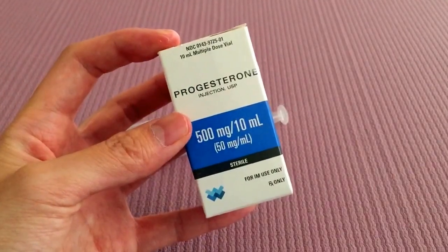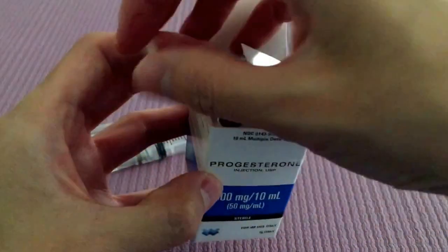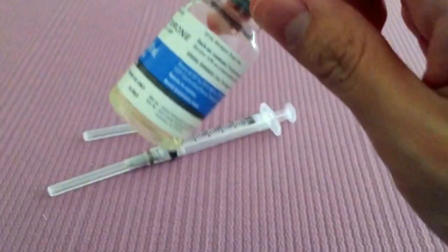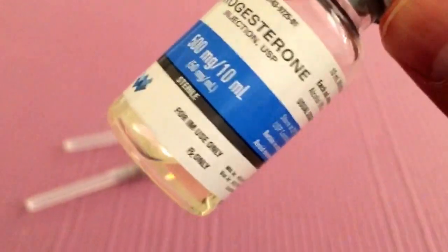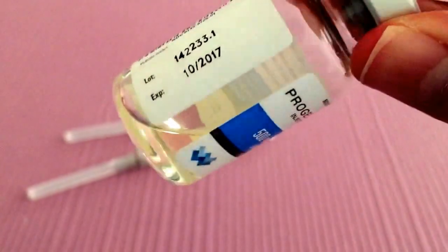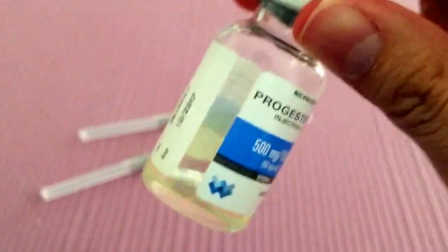Hi everyone, so this is progesterone in oil. Let's look at the vial. Inside you'll find a very thick yellowish liquid. It kind of looks like olive oil.